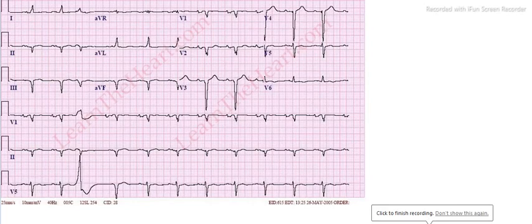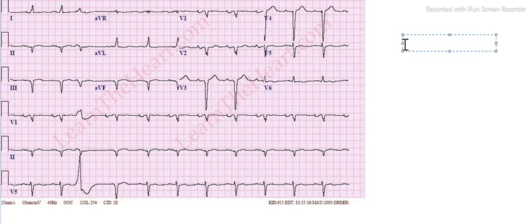Greetings to all. In this video, we will be discussing atrial enlargement. In theoretical lectures, we have already discussed which leads are to be looked at to find the P wave morphology: one being lead 2 and another being lead V1. So why do we need to look at them?